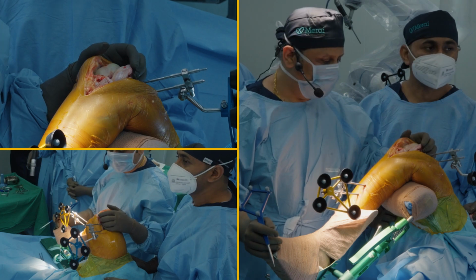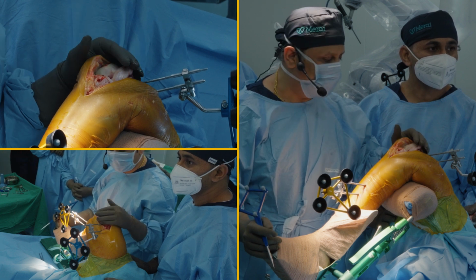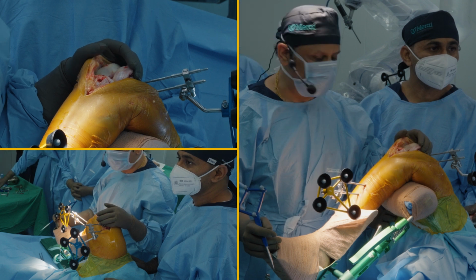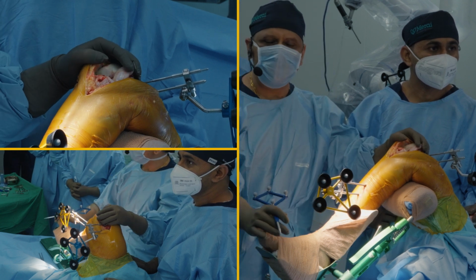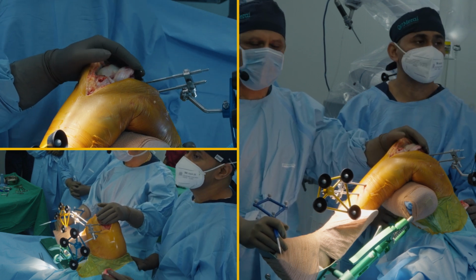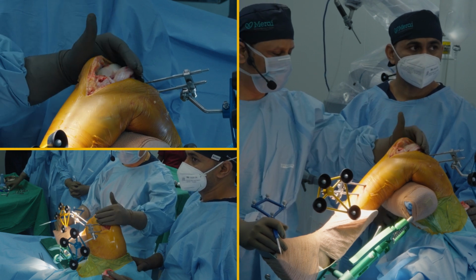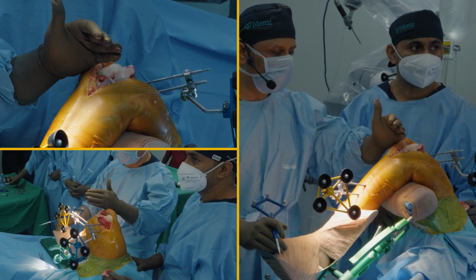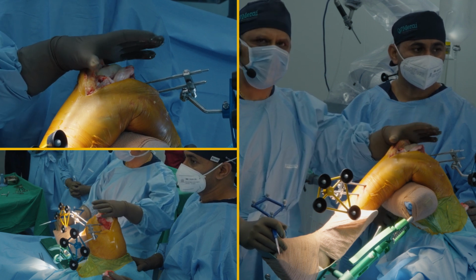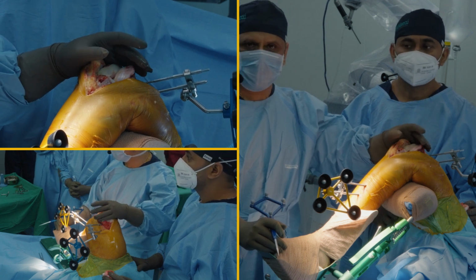Good evening, guys. So today I'm going to demonstrate the right knee surgery. This will be done through the Misso robotic system, which is a fully automated robotic system. I have done the CT markings before coming into the operation theater. I have marked my points on the femur and the tibia. I have taken D femur, and I will see how it goes once I do all the CT markings. Then I will show you the gap charts, any intraoperative variations, and how the system maneuverability is.